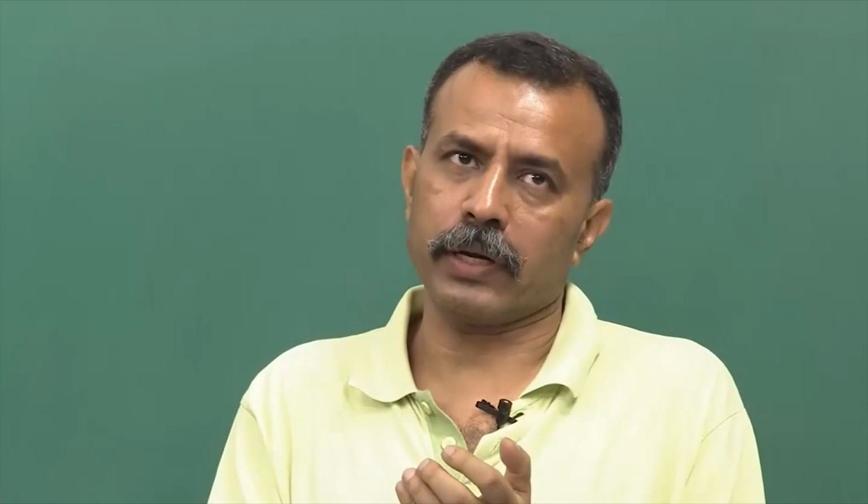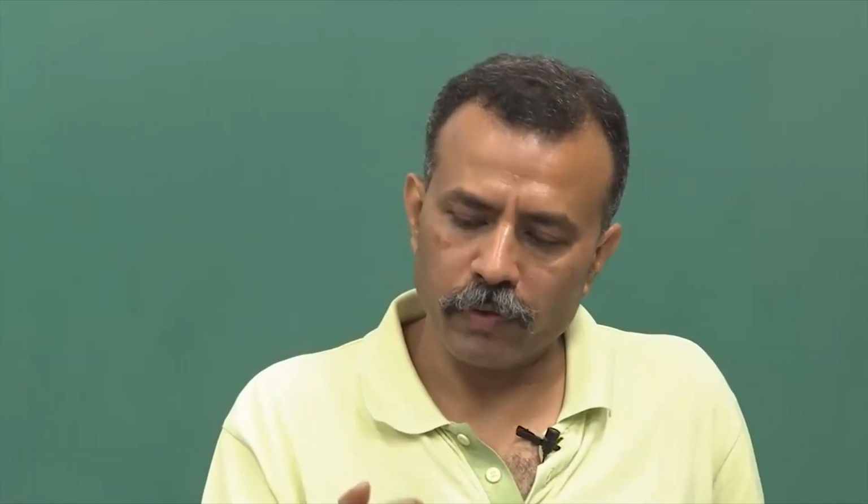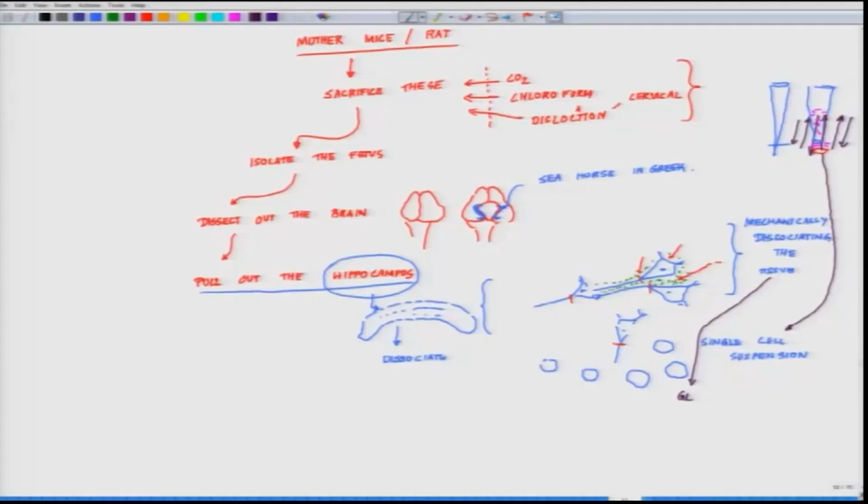You ensure that you are not picking up air bubbles. Those air bubbles damage the tissue big time. So, you will always have to do it very gently. There are some thumb rules in mechanical dissociation. You have to be very gentle and a fairly smooth process. It has to be done with utmost care.